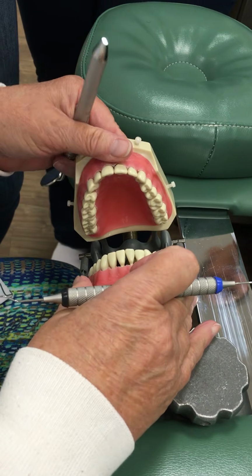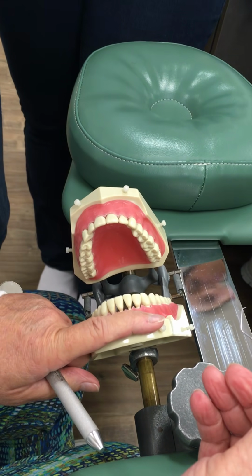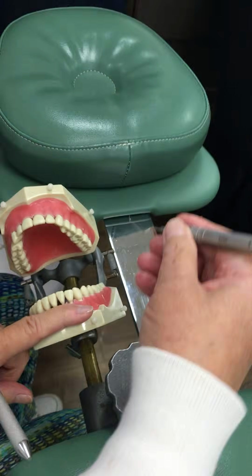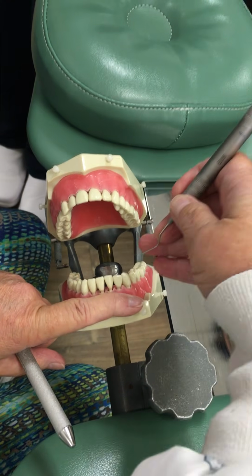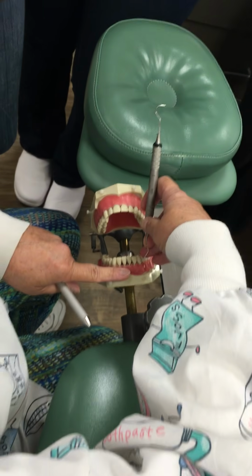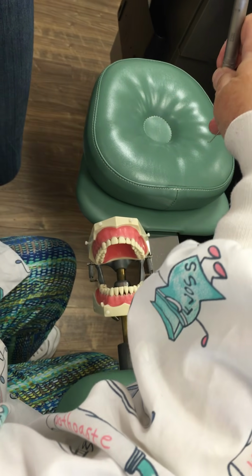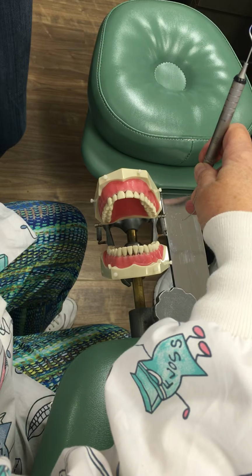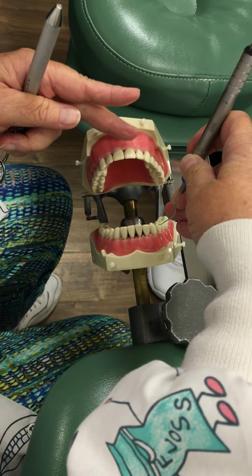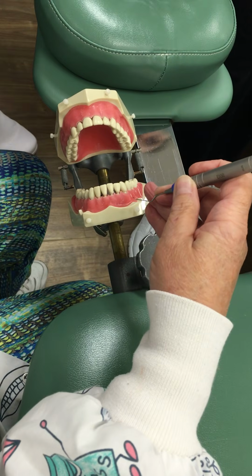All right. And we're going to palm our mirror and retract the lip now with our index finger of our non-dominant hand. And we're going to place our fulcrum kind of built up with our arm over the patient. And our toe now of our working end is going to be toward us. So we have the toe in the toward direction. We're going to do the toward surfaces, and we are in the toward position. Toward, toward, toward. Got it?